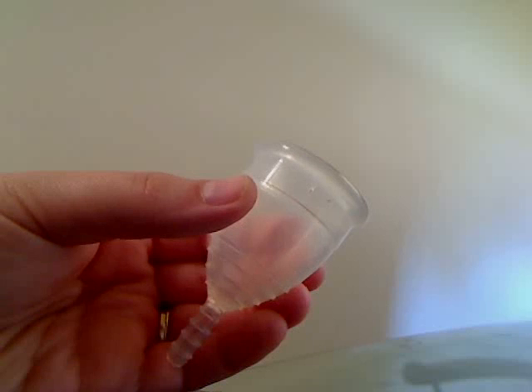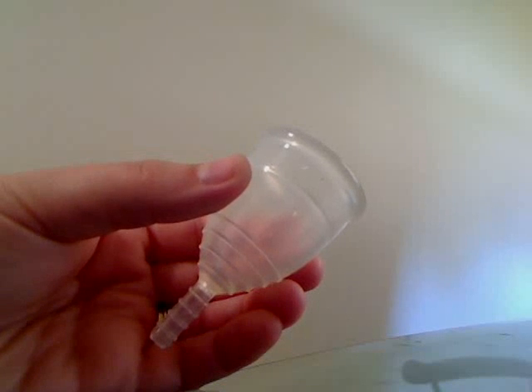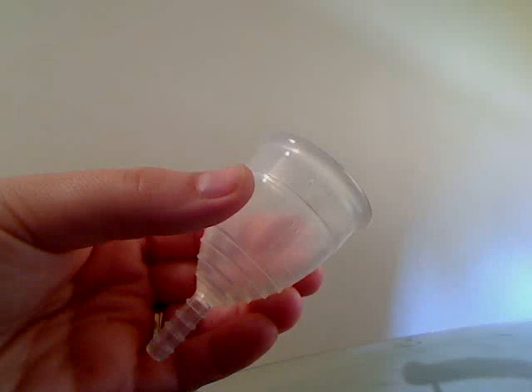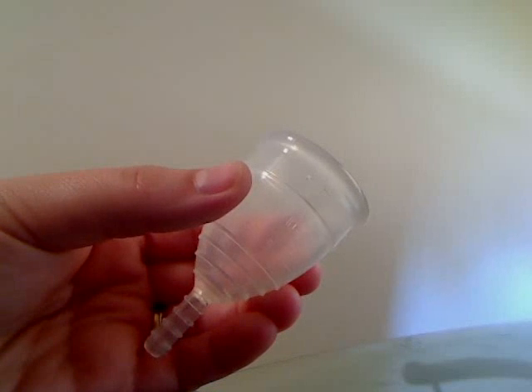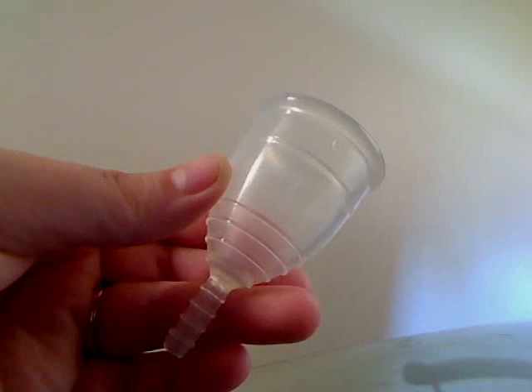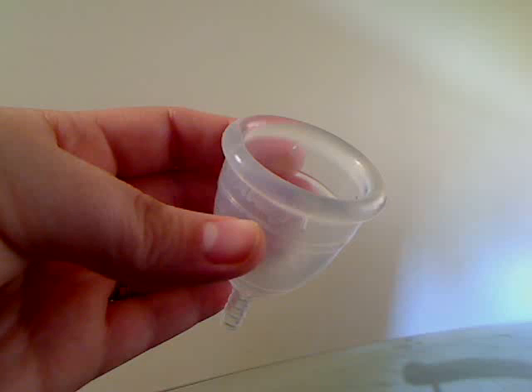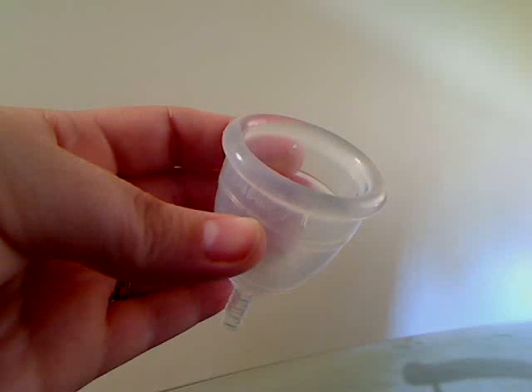First you're probably going to want to know what a menstrual cup is. It's basically this — a flexible rubbery cup made out of medical grade silicone, and it's a reusable alternative to tampons. Because it's made out of medical grade silicone, it has natural antibacterial properties, and it doesn't absorb anything, so it has not been associated with toxic shock syndrome.